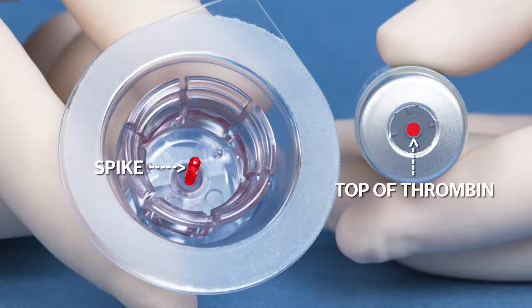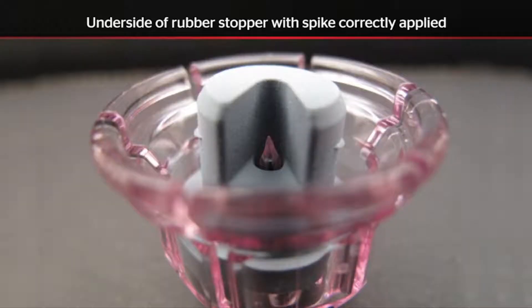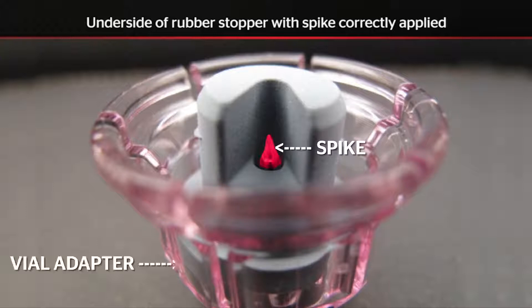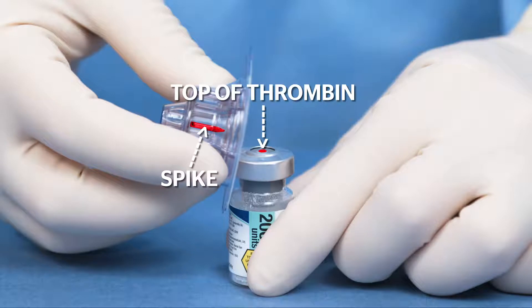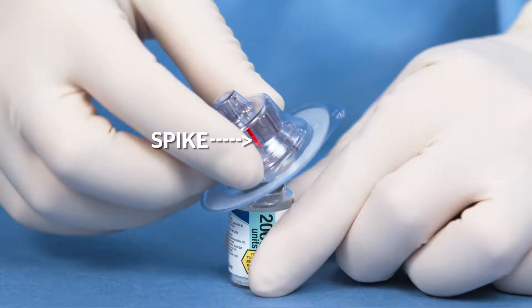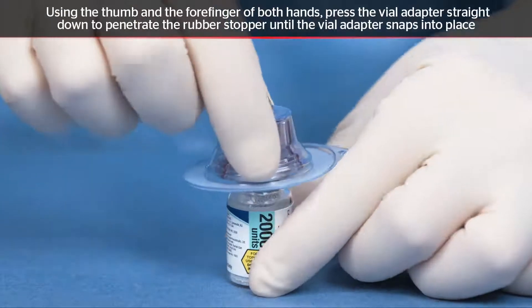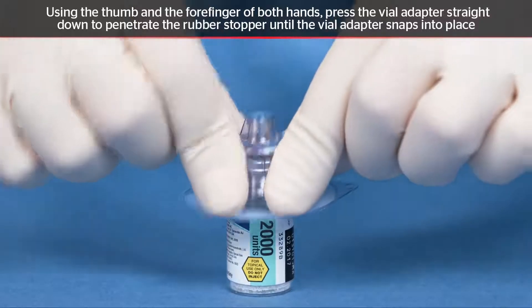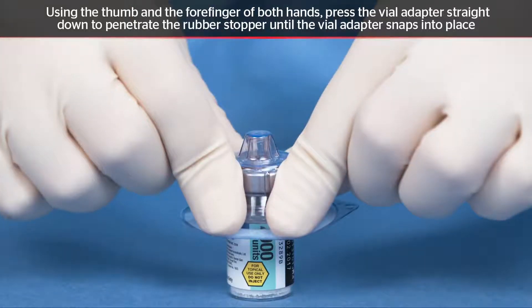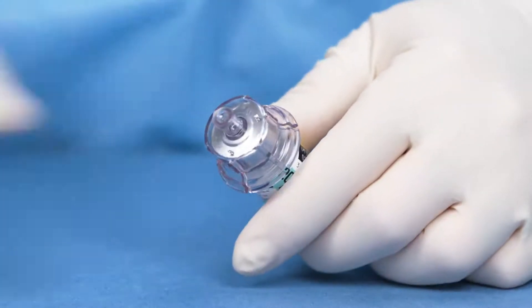Align the spike of the vial adapter to the center of the thrombin vial — proper alignment is key to successfully spiking the vial. It is important to carefully perform the following steps to ensure that the spike is centered and fully penetrates the rubber stopper in the appropriate target zone. Seat the vial adapter on the thrombin vial on a flat surface, pushing down using the thumb and forefinger of both hands until the spike penetrates the rubber stopper and the vial adapter snaps into place. Remove the vial adapter package.